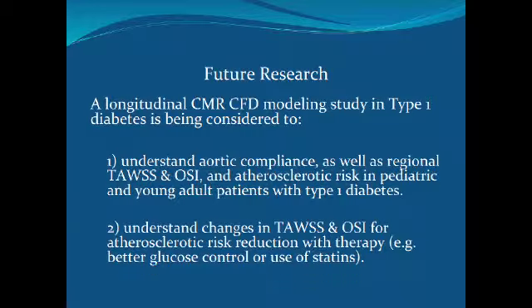The volunteers laid on the scanner and pedaled, and we imaged them while they were pedaling. It took a lot of finagling because your knees hit the bore of the magnet, so we had to look at the difference of scanning off isocenter. So a lot of engineering goes into some of these projects, and I can't thank John and his group enough for assisting me with learning how to use MRI to a greater extent than I'm currently doing it.